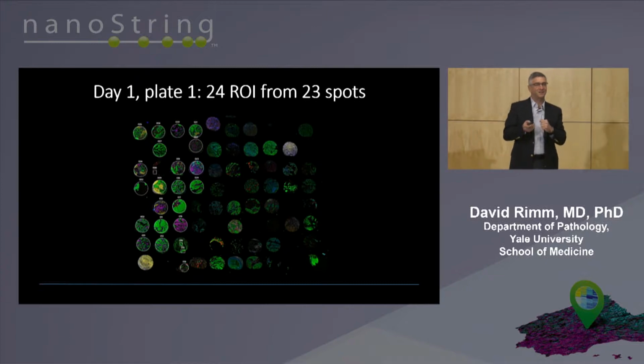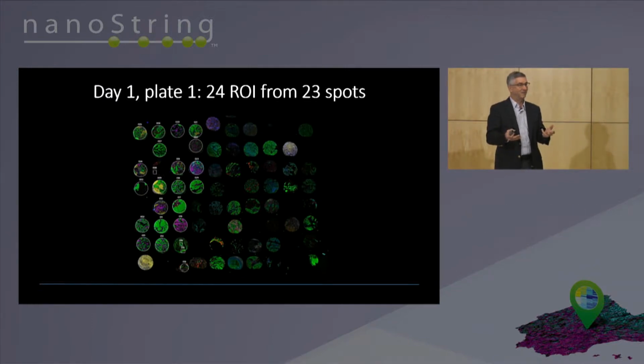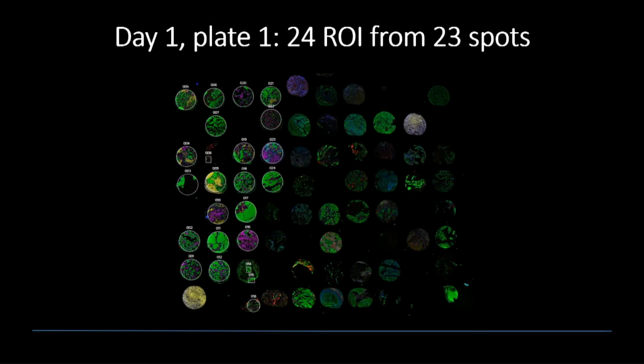And I think this is interesting because TMA spots, as people who know TMAs know, they're not perfect. And a lot of times, you get something like the little square that you can see on the upper left-hand side, because that's the only part of the TMA we could actually read. And so we couldn't read the whole spot, so we had to read less than that.